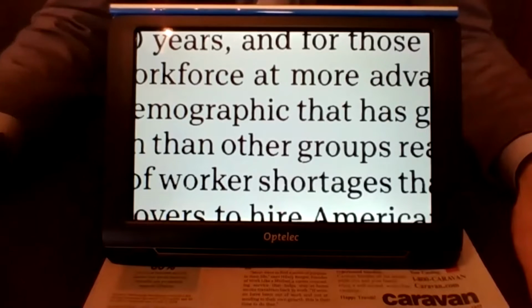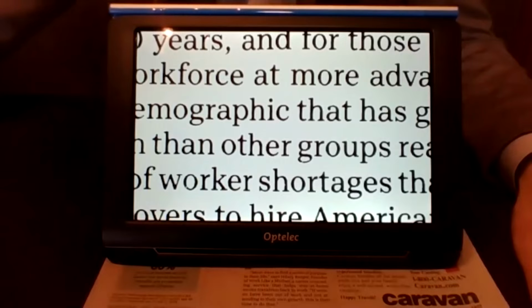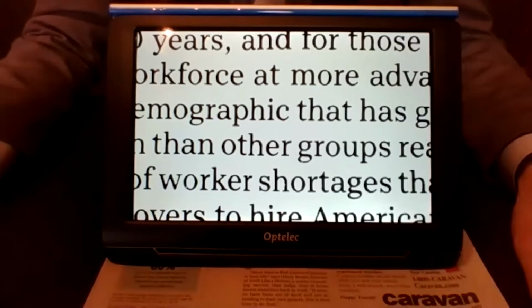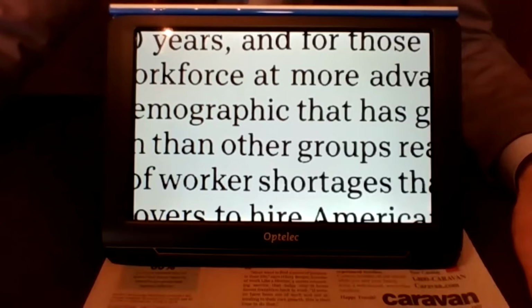This particular feature I really like because it eliminates something some clients may find slightly difficult. And again, for the reason of removing barriers, having the feature to snapshot something, as in the example I gave, if you're in a coffee shop, you could magnify it and pan around.